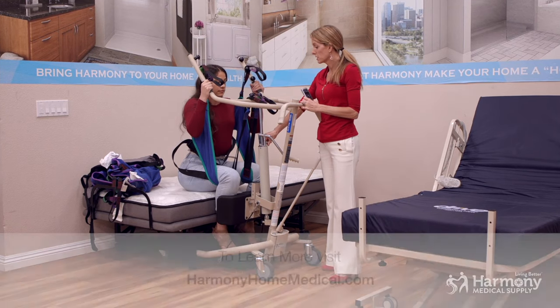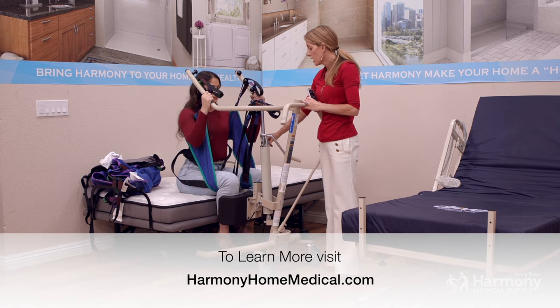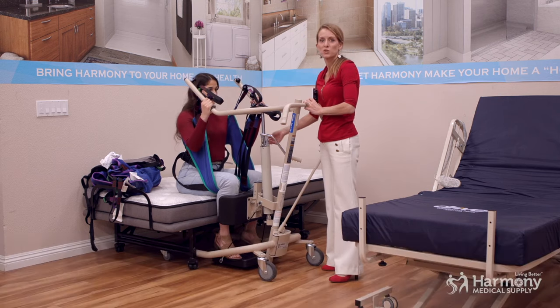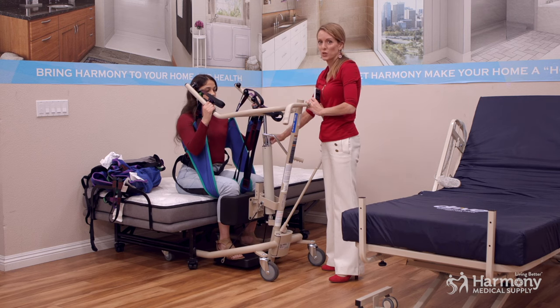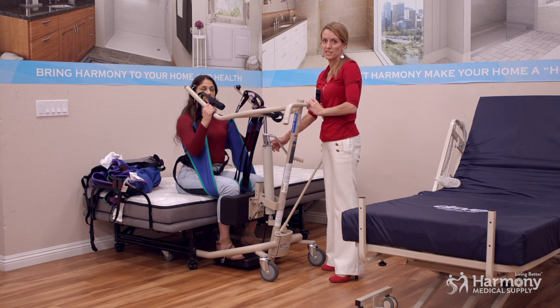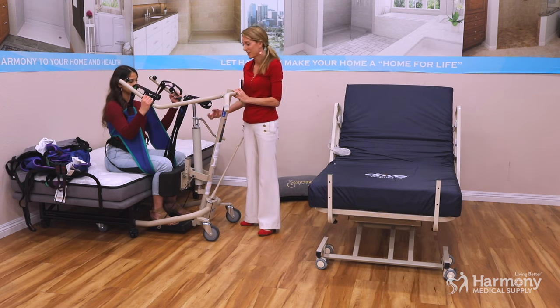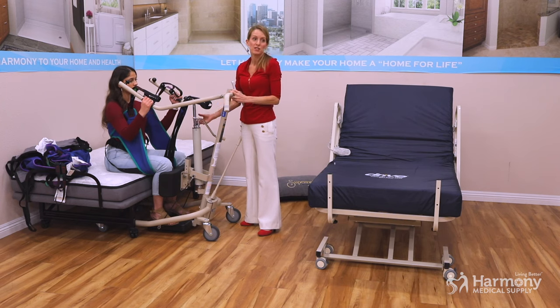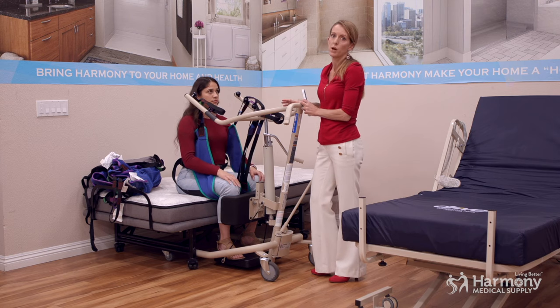With hydraulic patient lifts that have valves, when they're nice and new the descent is gradual and comes down nice and slow. Over time they can get a little worn, so you want to gauge how quickly the valve releases. I've had the scenario where you hit open and it just goes way too fast. So always be safe — always make sure you're letting the level down slowly and into the right position. This sling and lift setup can certainly help you do that.